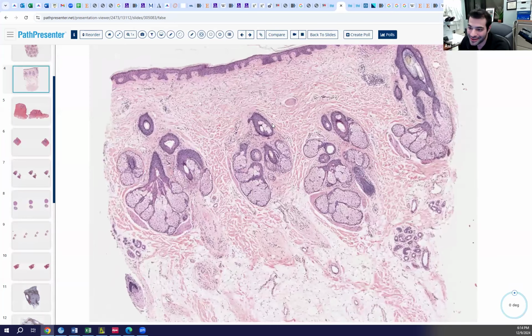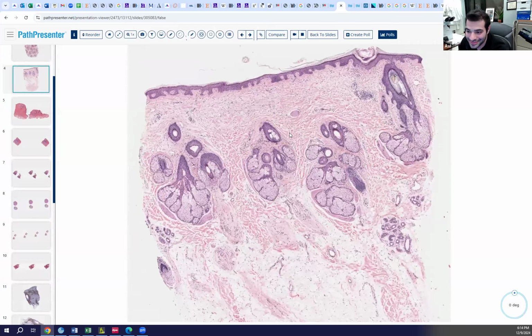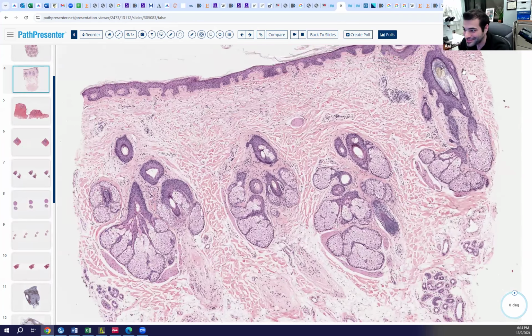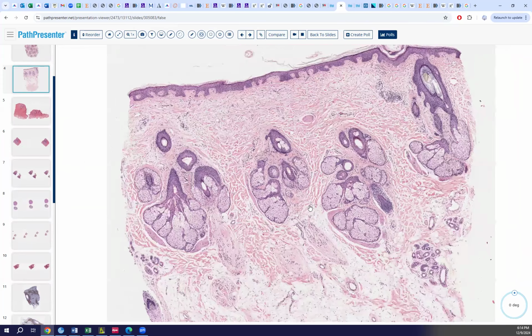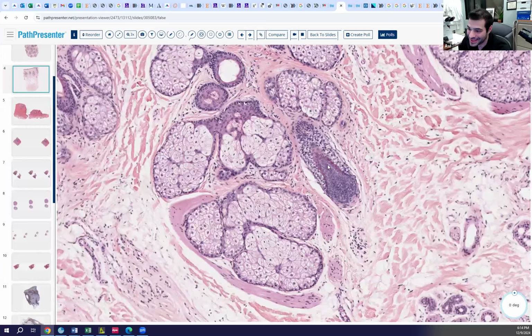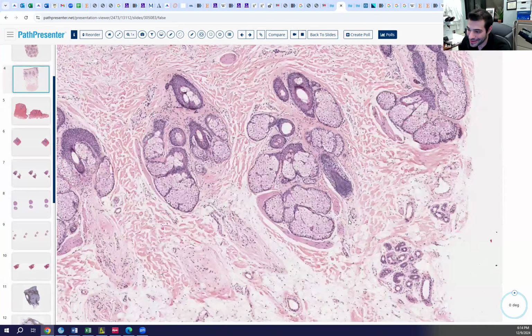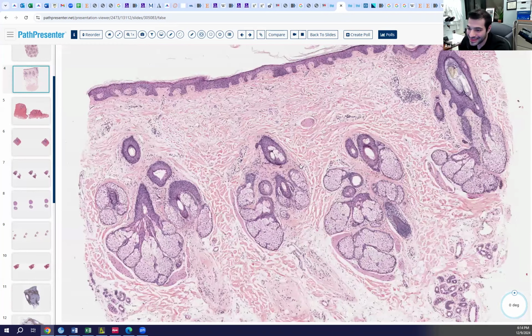Now here's how you're going to see it if you're signing out with us. So what's this? Number? Fine, but very fine. Size? Small. And again, see how this is all the way up here? It's supposed to be all the way down here. AGA.